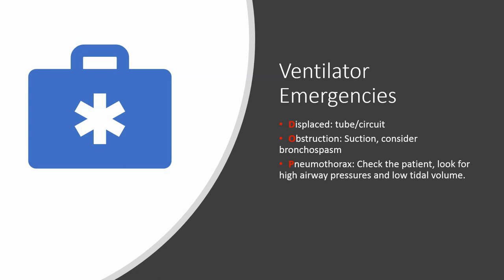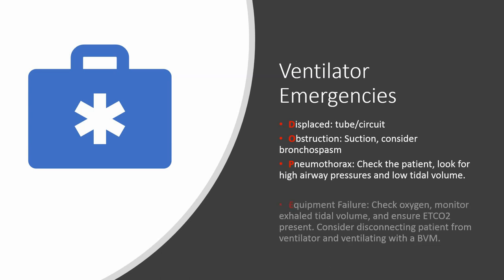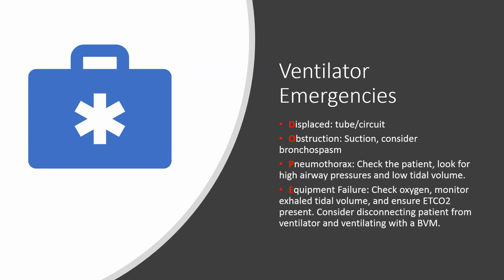Always consider a pneumothorax. So you check the patient, look for high airway pressures or low expired minute volume. So listen to breath sounds and equipment failure. This is not all that uncommon. So make sure you're connected to oxygen. The oxygen is running. Make sure you're not out of oxygen. Monitor your exhaled tidal volume and always, always, always ensure that you have end-tidal CO2. End-tidal CO2 should be the first thing that goes on every single tube, every single time.